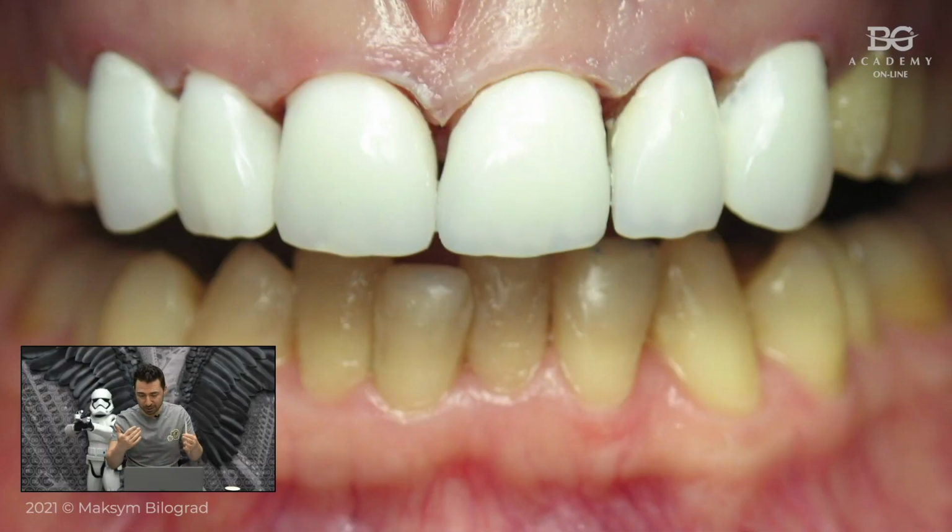So this is our provisionals placed into the patient's mouth. Now you understand me, right? And imagine what happened next. Instead of saying that this is ugly disbalance, she said, "Wow." She was actually screaming, "Wow, doctor, these are the shades that I was dreaming about my life. So you are a very great professional. Your dental technician is one of the best. Please do the final restorations immediately."